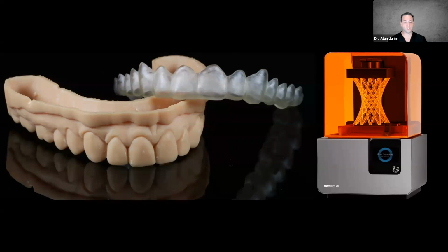You know, we've had patients who we did veneers on, or a cosmetic case from 5 years ago, and then it's 5 years later and they come back and they say everything's shifted, everything's moved. They're concerned that they've had a relapse in ortho. Well, we take a new scan and we can compare it to the scan from 5 years ago. And that's a tremendous benefit.